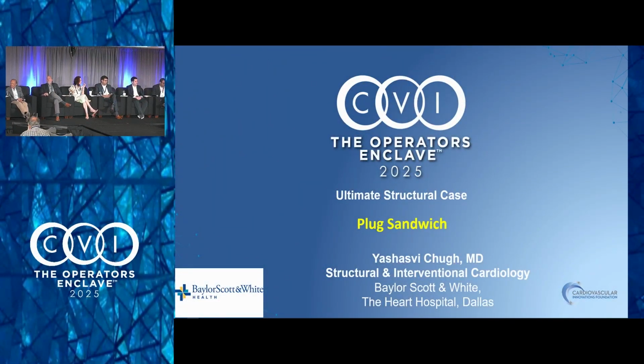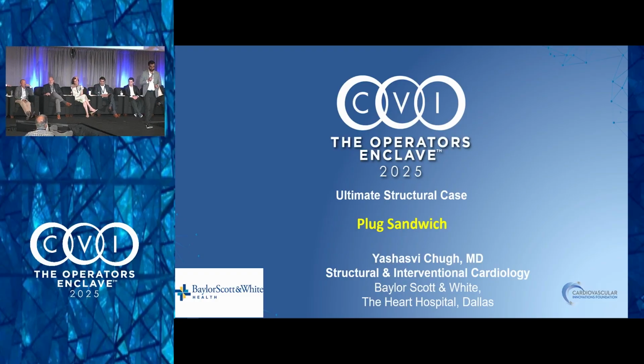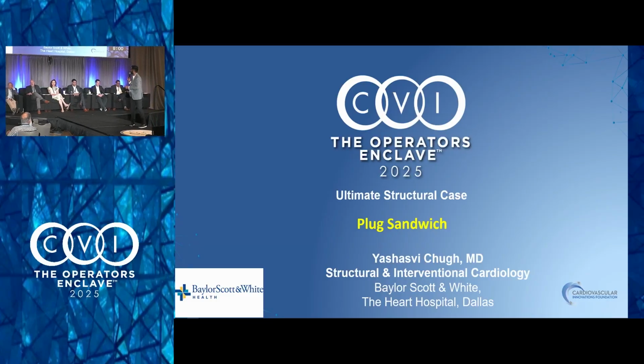In the interest of time, we should move on to the next case. Yashasvi Chugh is going to present complex transcatheter defect therapy. Plug sandwich. Thank you so much, Dr. Sorajja, for having me.